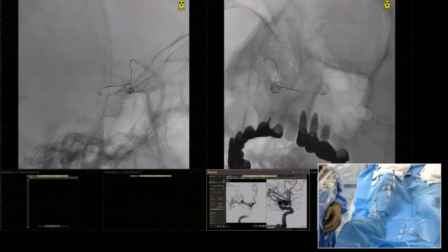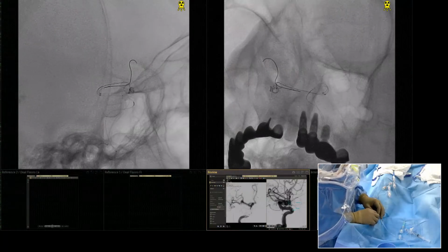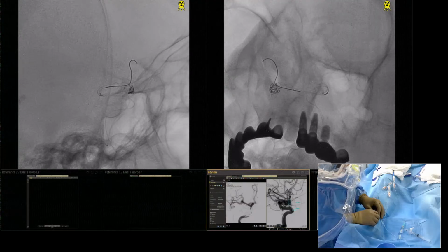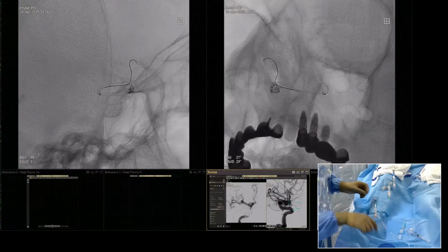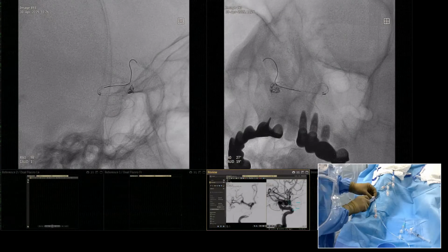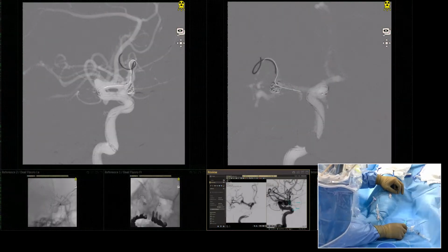Okay. Not bad and not good, huh? I think mostly the lateral plane. This plane is more informative, yes. I think now is better. Yes, now is better, I think. The coil placed as we wanted. It's inside that. Yes, we're also pushing the stent, eh?